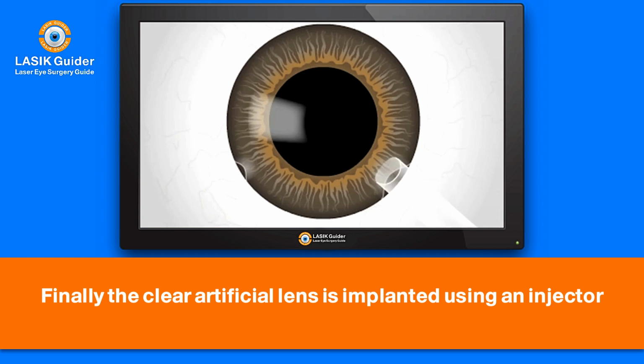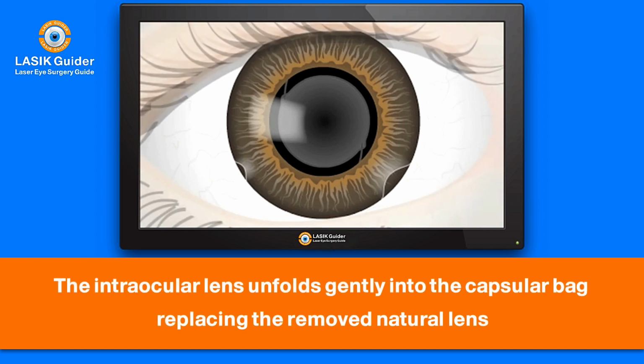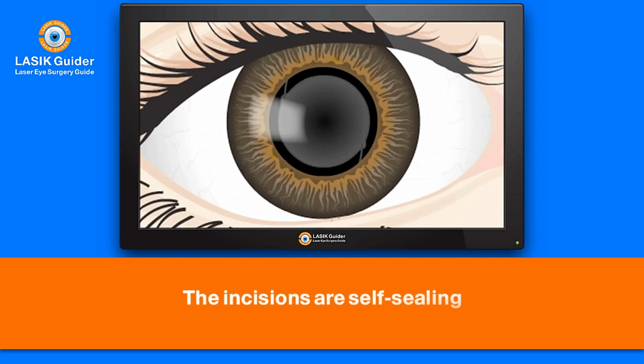Finally, the clear artificial lens is implanted using an injector. The intraocular lens unfolds gently into the capsular bag, replacing the removed natural lens. The incisions are self-sealing.